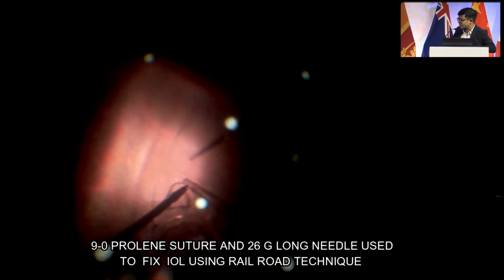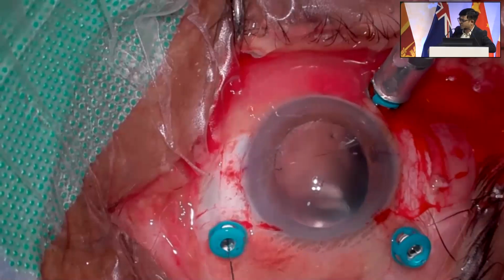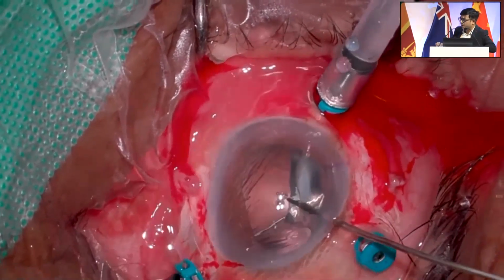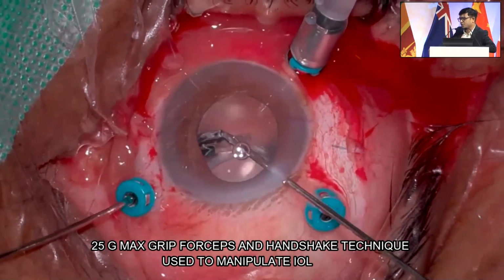The advantage of such a technique is that, first, I have not made any corneal incision, just a small side port. No scleral incision, intraoperative IOP control is good, there is no post-op astigmatism, and lastly, it is cost effective because I have used the same IOL.